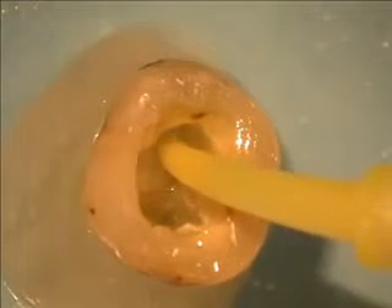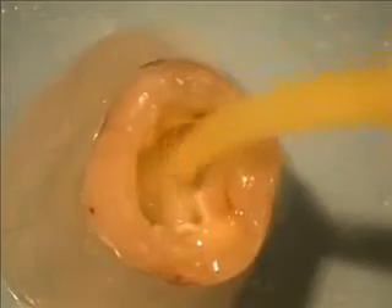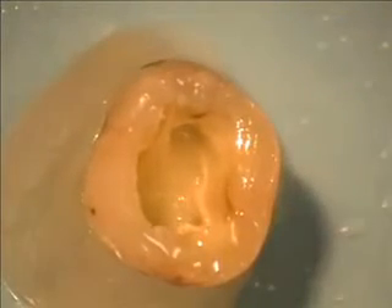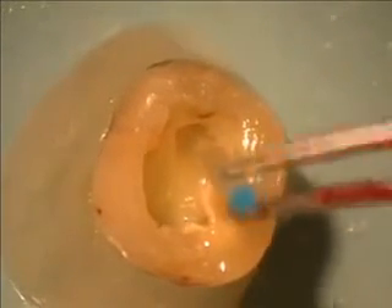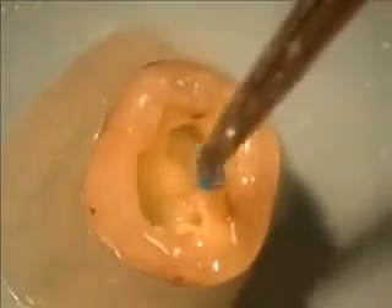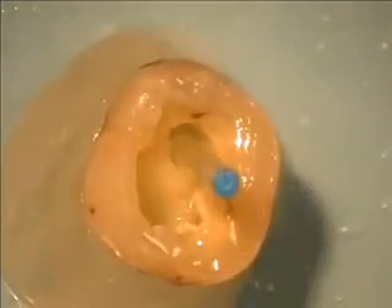Anchor, which is both a post luting material as well as the core buildup material, is injected into the canal and the post spaces adjacent to approximately a millimeter or two. The Unicore post is now inserted into the post space and seated all the way.